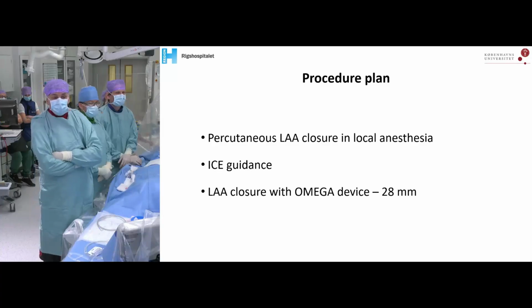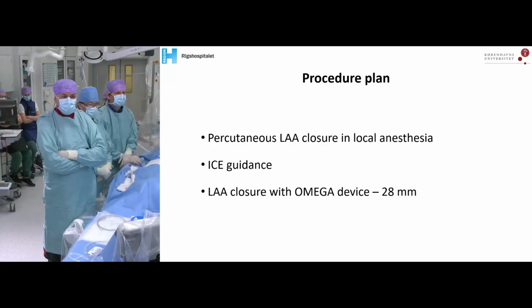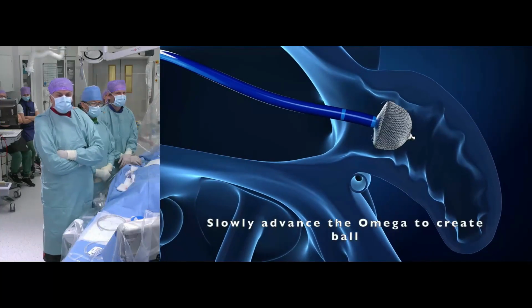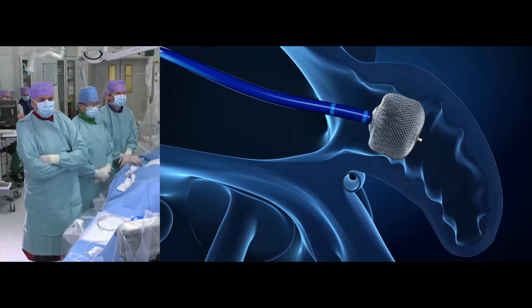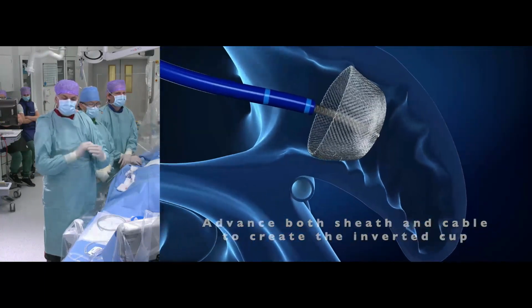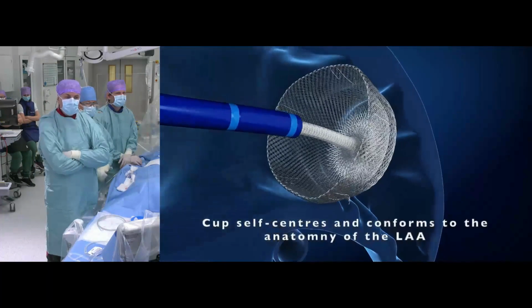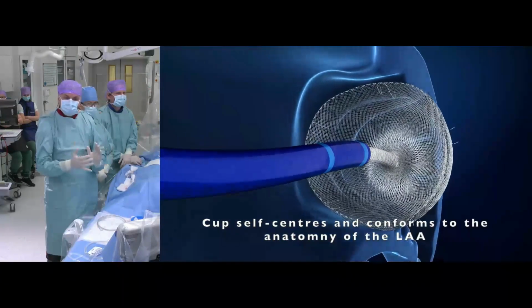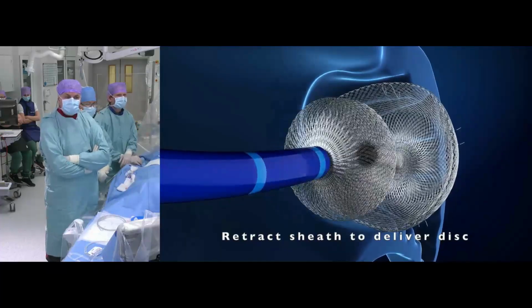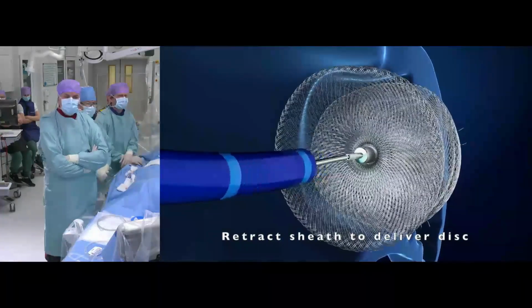So this is the plan. Percutaneous LAA closure, patient is fully awake under local anesthesia. It will be guided by intracardiac echo. We're going to use an Omega device, 28 millimeter. Next slide. This is just a short animation of how it works. So you form first a lobe and then you push it in. So it is configured into a cup, which is going to actually conform and self-center in the appendage. And then next you form a disc, which is going to seal off the ostium.